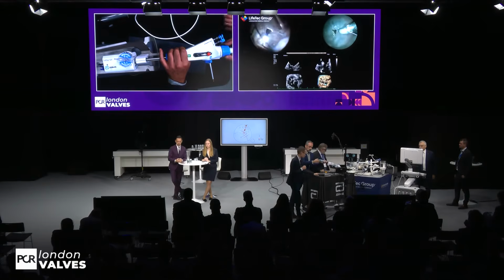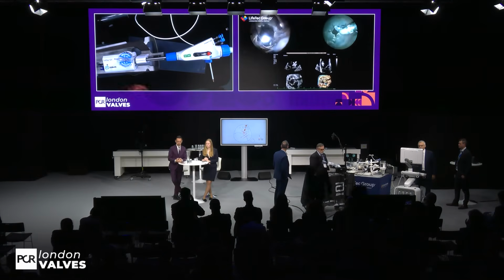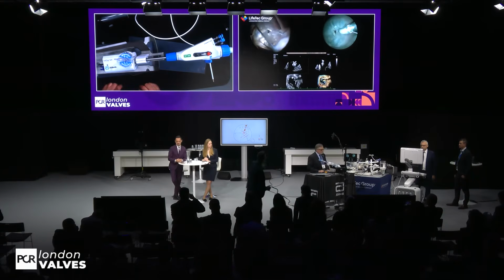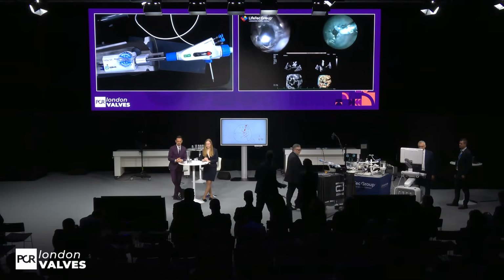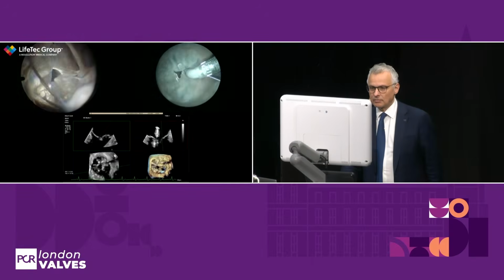Okay. So I will change now the MPR to follow the procedure. So we align now to the device. In this case, we have this anatomy. So what would you do? What would you try? Where would you put the clip? As has been said previously, we have to start with the septal and the anterior leaflet. First clip, and then we can decide.